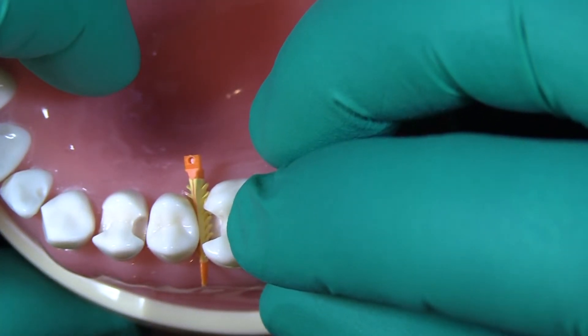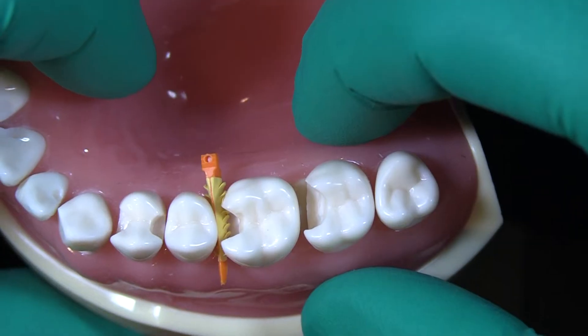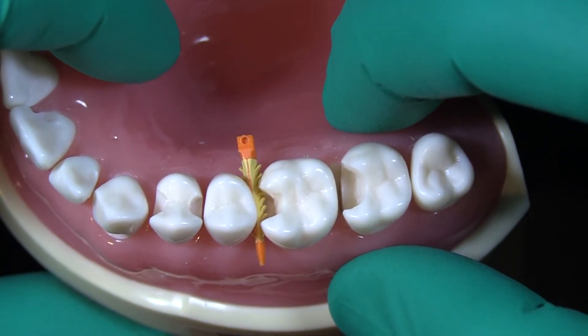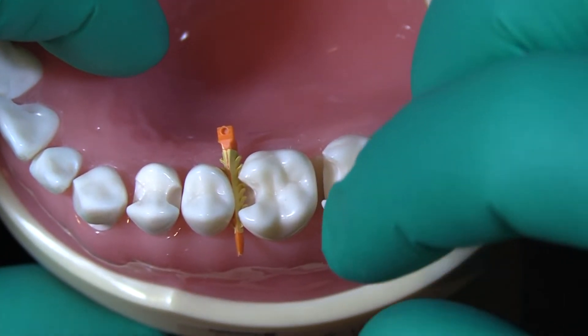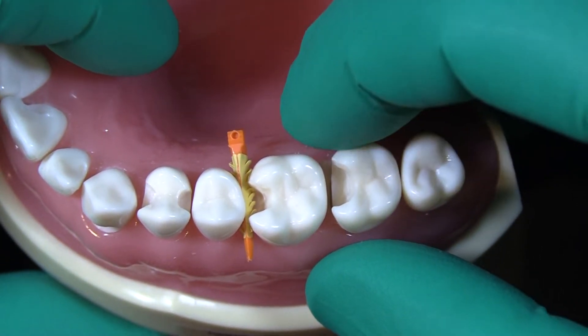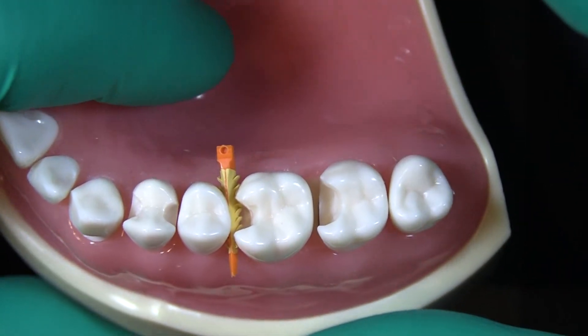See those little fins that stick out — we want those engaging the side of the tooth, not going into your preparation. If you try to restore it like that, it's going to distort your matrix band. That's going to prevent the matrix band from sealing up against the margin, and you could potentially be leaving yourself open to overhangs, poorly contoured restorations, and other issues.